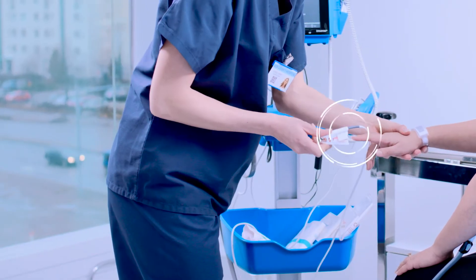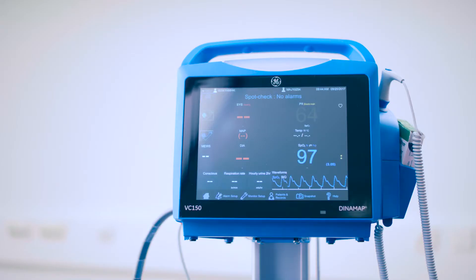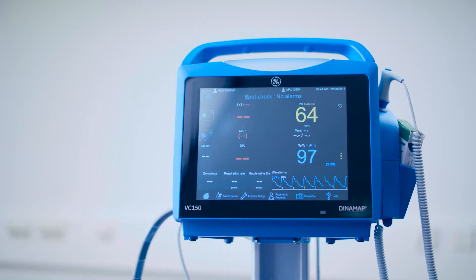CareScape VC 150 Monitor starts measuring a patient's SPO2 right after the sensor has been placed on a patient's finger. Technologies include choice of TrueSignal, Massimo Rainbow Set, or Nellcor SPO2 measurement.